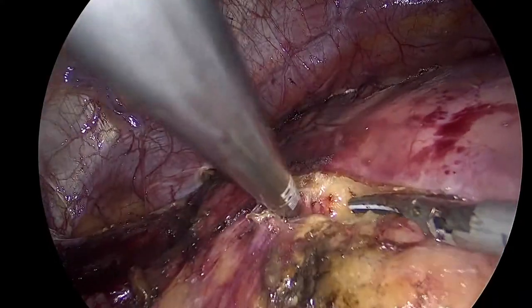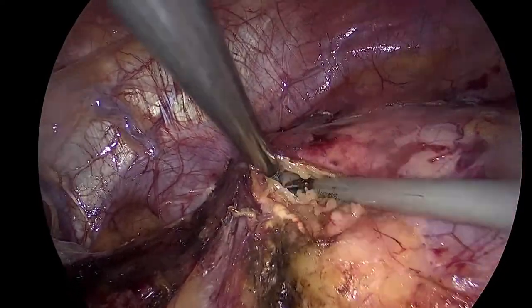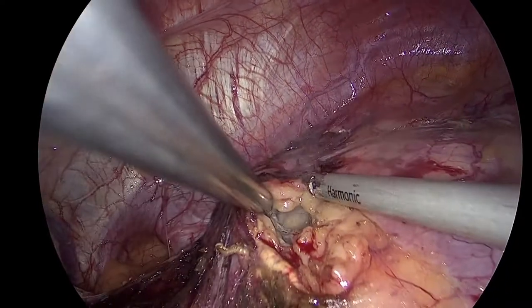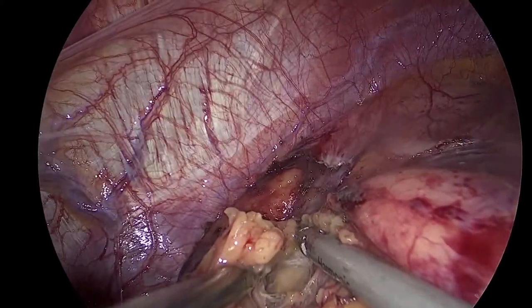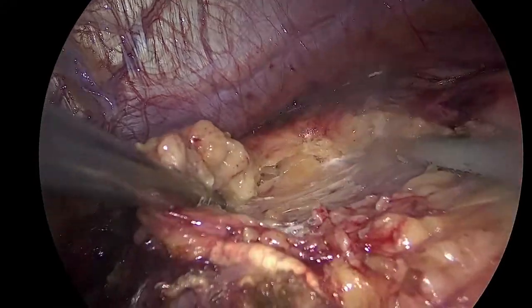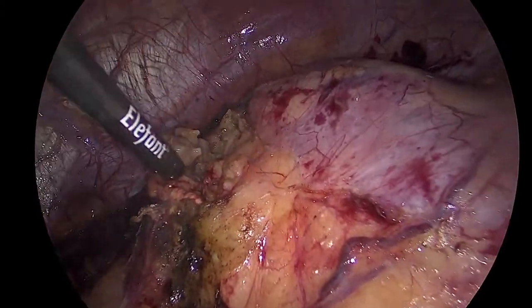Good. So we see the adrenal is here, huh? That's it. So what we do is we create bluntly a space towards the inner side, and you just cut because you've already mobilized everything, eh? I repeat, one could say, why are you doing this? You have a lower pole tumor. Because as I said, I want to be prepared for everything. So a partial nephrectomy for me is always preparing the kidney for a radical first, and then when everything is prepared, then you do a nice job.